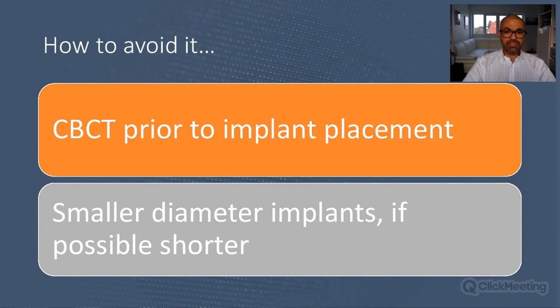when we place a central incisor implant that the diameter should exceed 4.5 millimeters or even 5 millimeters. This is today completely wrong. We need more bone to create. This is number one. Number two, if we reduce the diameter of our implants, the risk of harming these sensitive anatomical structures is reduced dramatically.